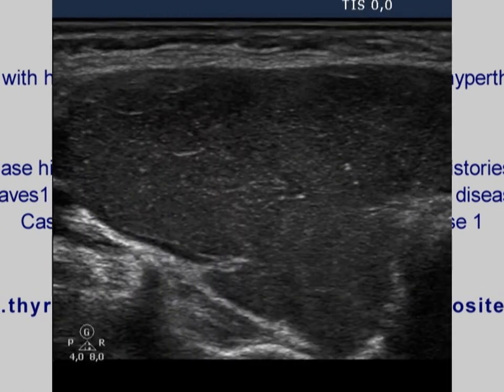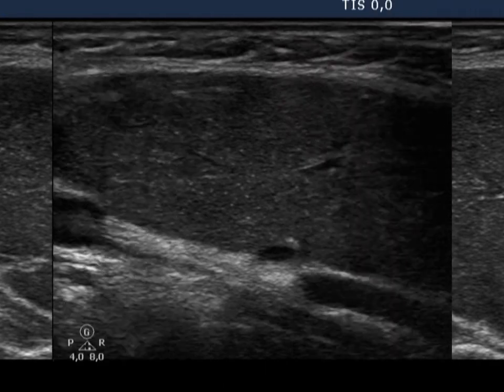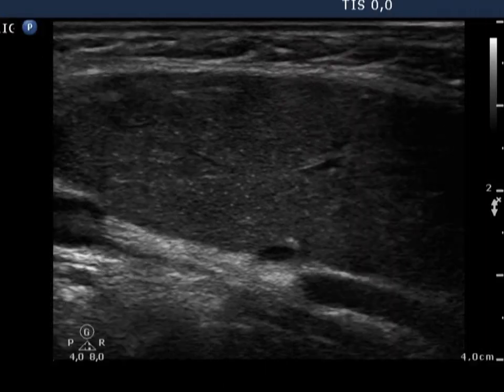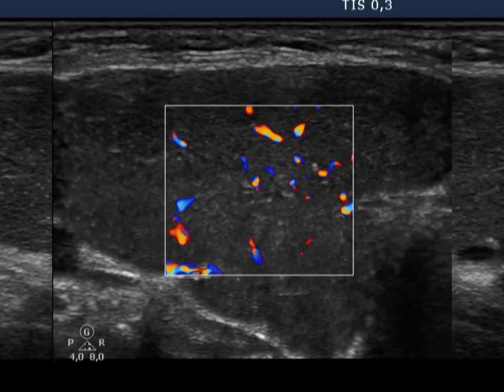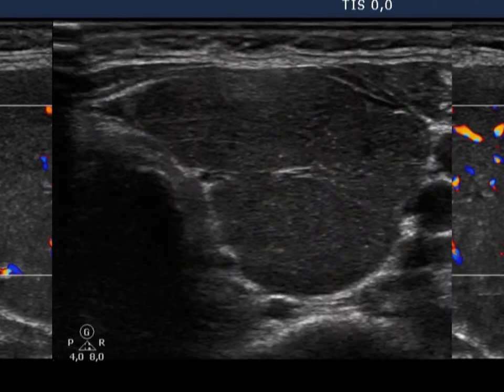The diffusely hypoechoic pattern proves that the patient has autoimmune disease. The thyroid is enlarged. The vascularization is normal in the right lobe.